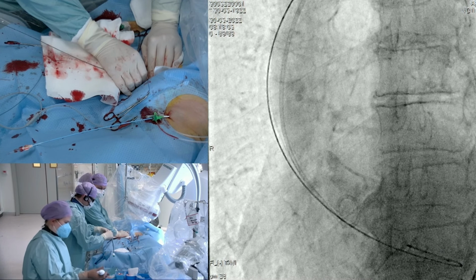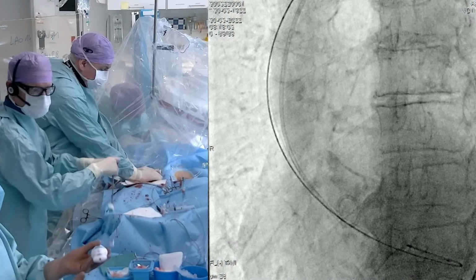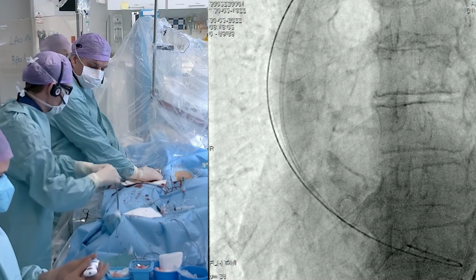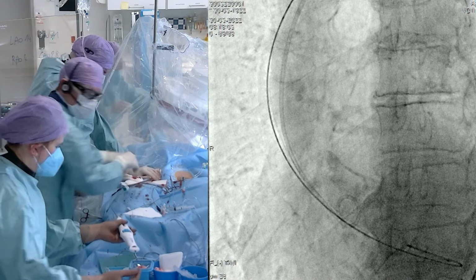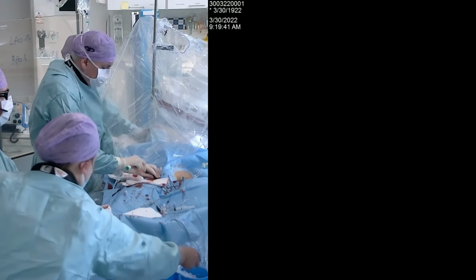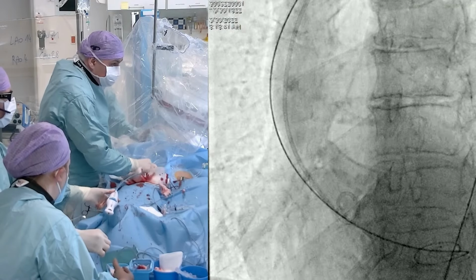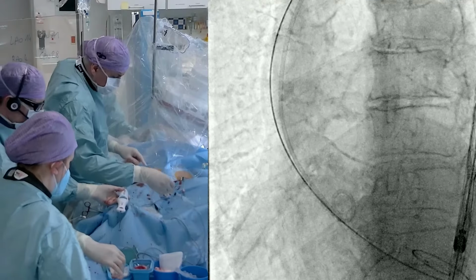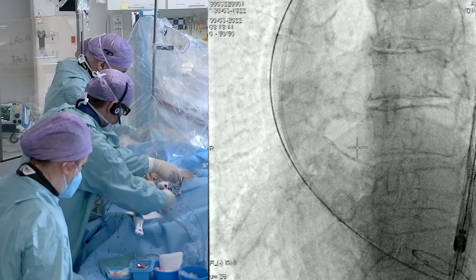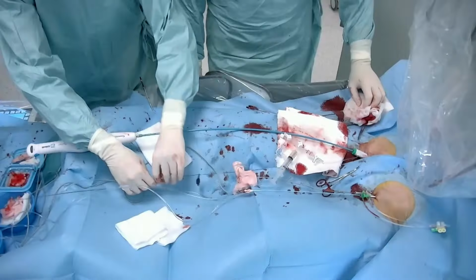And also it's a really nice delivery system here. It's hydrophilic coated, so it's often very easy to introduce it, and it's a very flexible system. Tiny bit over the sheath. Yep, that's better. I'll just take a little bit of saline here and a wet swab too. So we'll go in here, and that goes smooth up. And we can reconnect here to the pressure line. Then we can give also the end of the wire here for the potential need for pacing. Just connect it here.